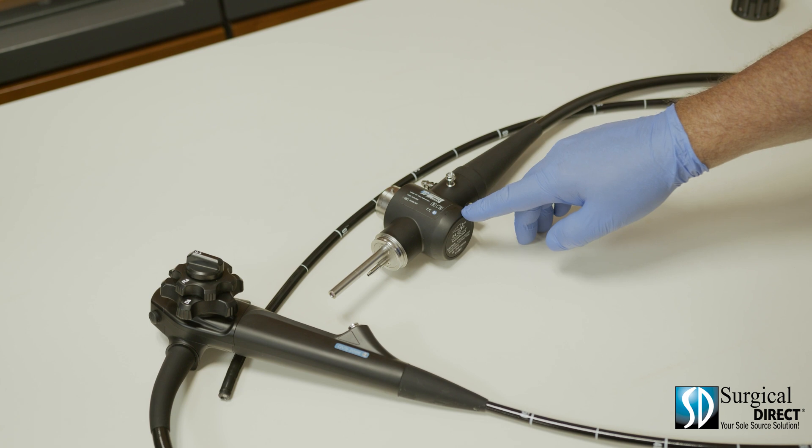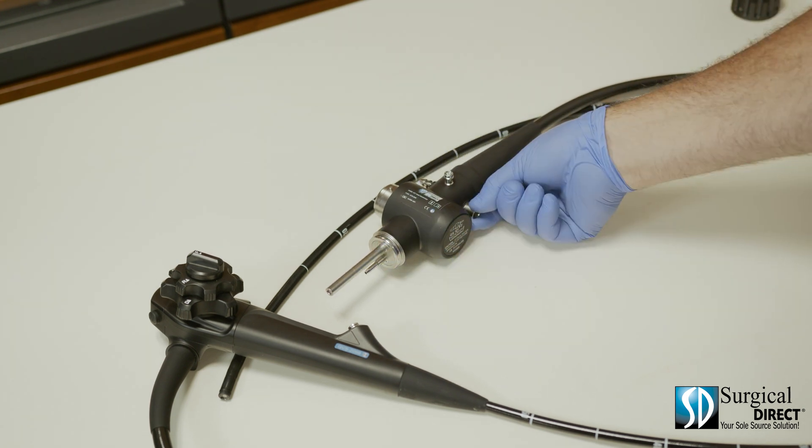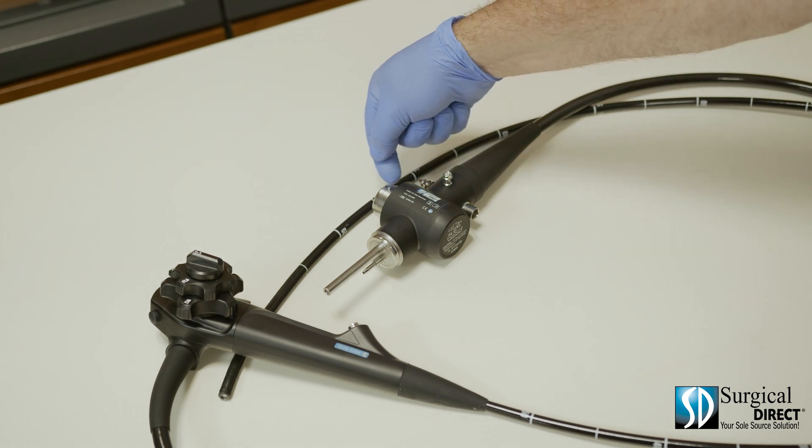This is the video hub of the scope. It includes the light post, the air post, the water inlet, the suction, and the video signal plug.